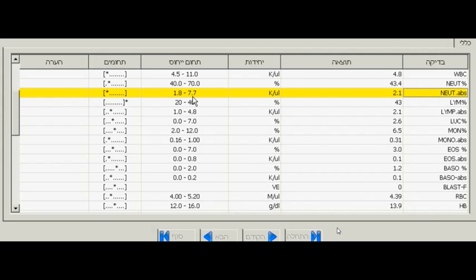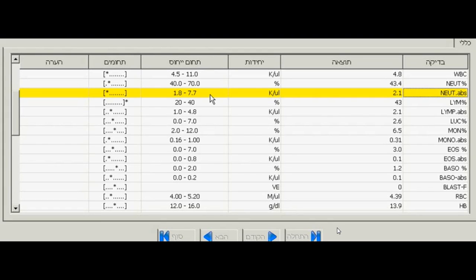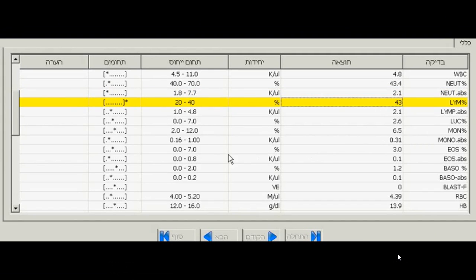Usually in that case also, when you are getting chemotherapy and it goes down under 1,000, although there's an increased risk, there's really nothing to do unless you have fever. Even usually you don't get fever even if the neutrophil absolute count gets less than 500. Now, the neutrophil absolute count is made up, as you can see, of the white blood count times the percent of the neutrophils.